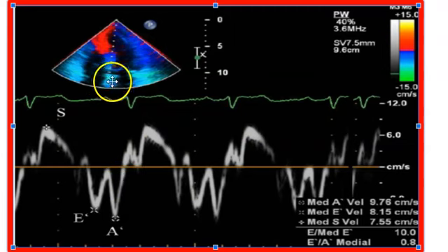And here's where we're measuring. We're measuring the movement of this myocardium. And we've marked out an E and an A. That's our E wave and A wave. We talked a little bit about that in class.